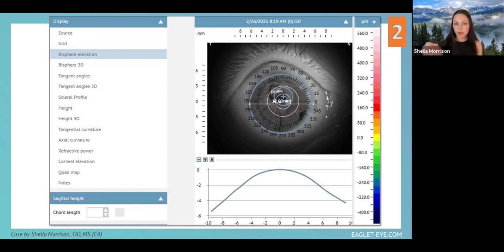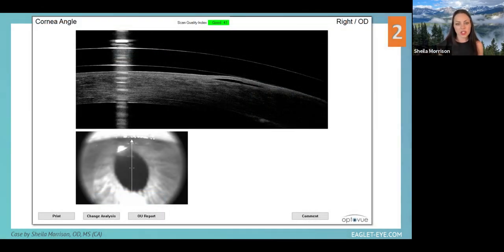We can choose exactly where we want our fenestrations. In this case, we also built a channel all the way through. Without fenestrations, you can see a little cystic sort of bubble. That's flat down with no lens. And after he had his surgery, wearing a piggyback, he was able to wear a lens with no swelling, but this is what happened with his scleral without fenestrations and channels.